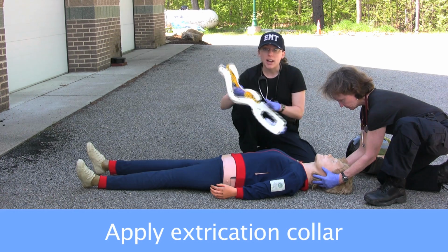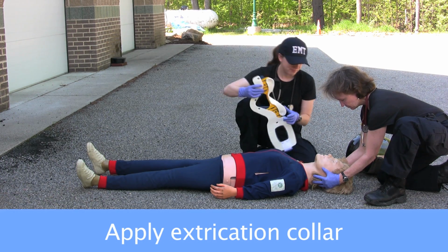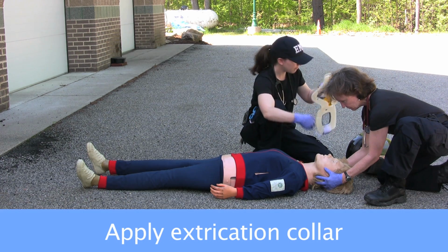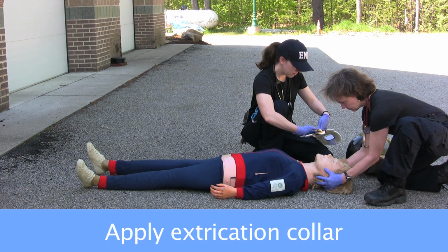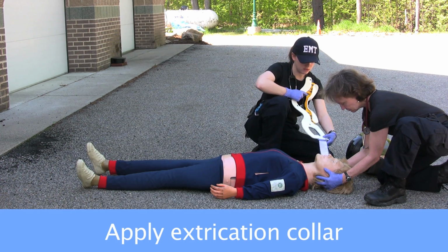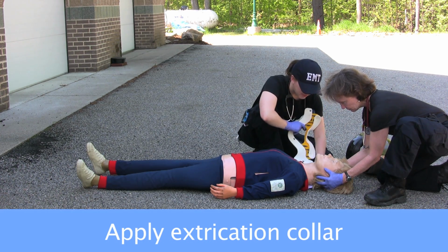Next, we have to apply a collar. I'm going to measure to make sure I have the correct size, which I like this size. It's not a small. And I'm going to start applying the collar.